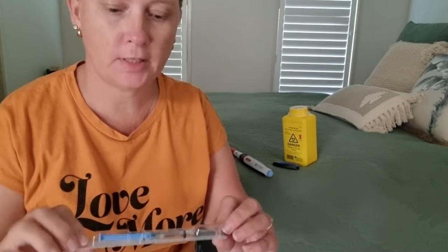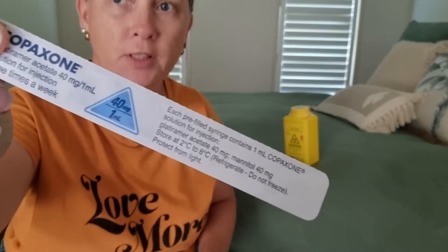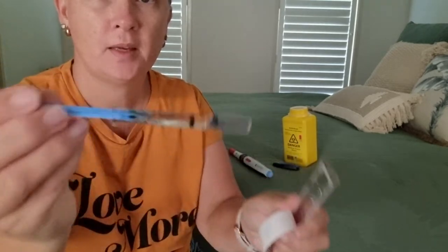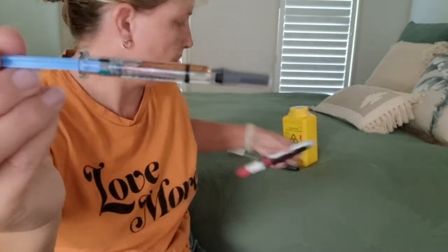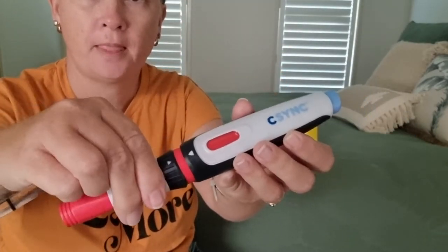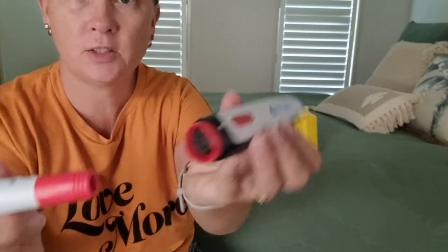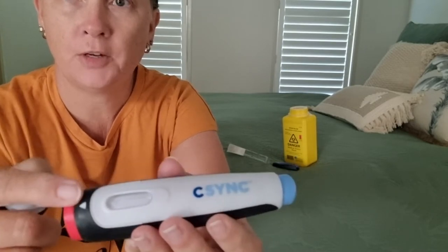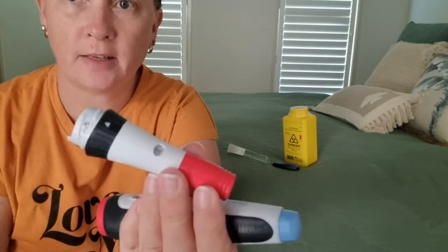We're going to do the auto injector. Here is my Copaxone that has come out of the fridge. Make sure you check your batch number and expiry date. Peel it open, pull your needle out — it's still intact. With your auto injector, squeeze and twist it open, then insert the needle onto the loader. Now it's white and it's ready.